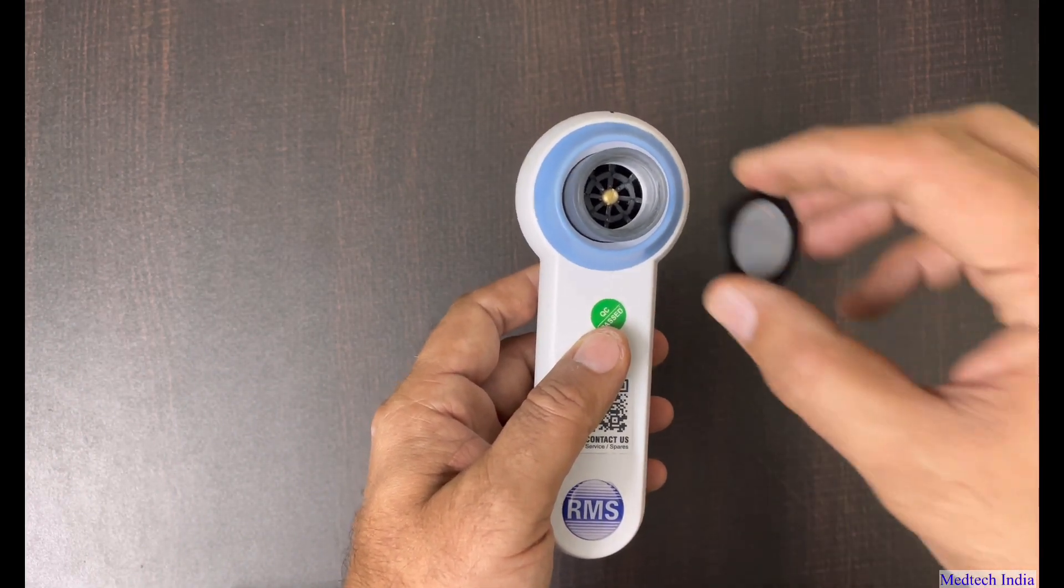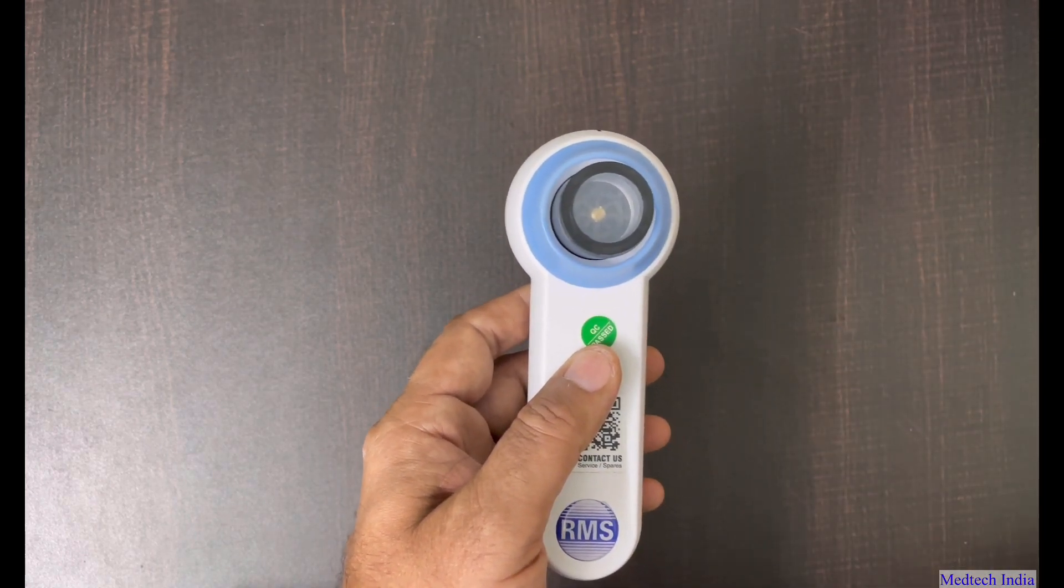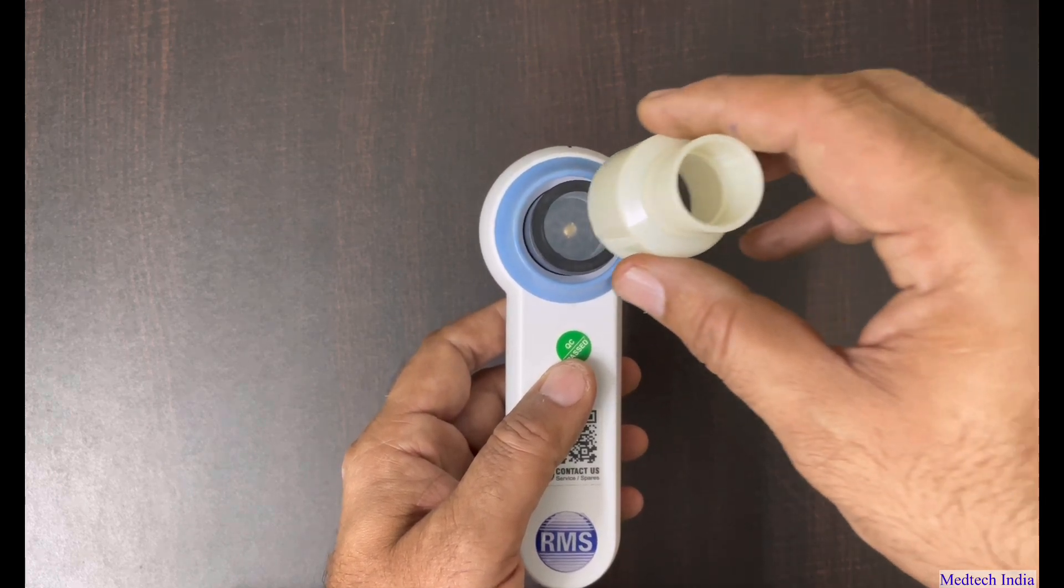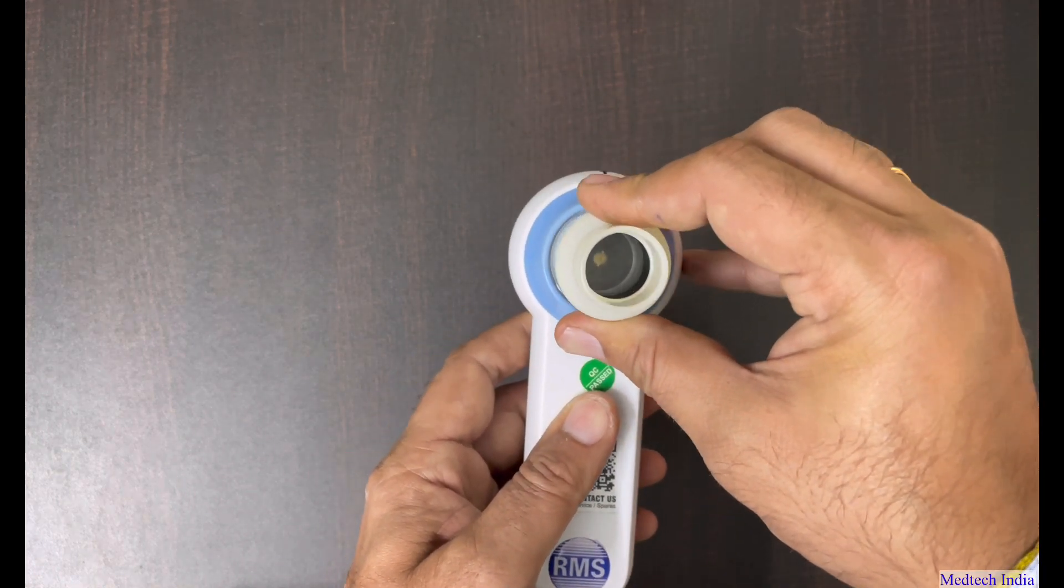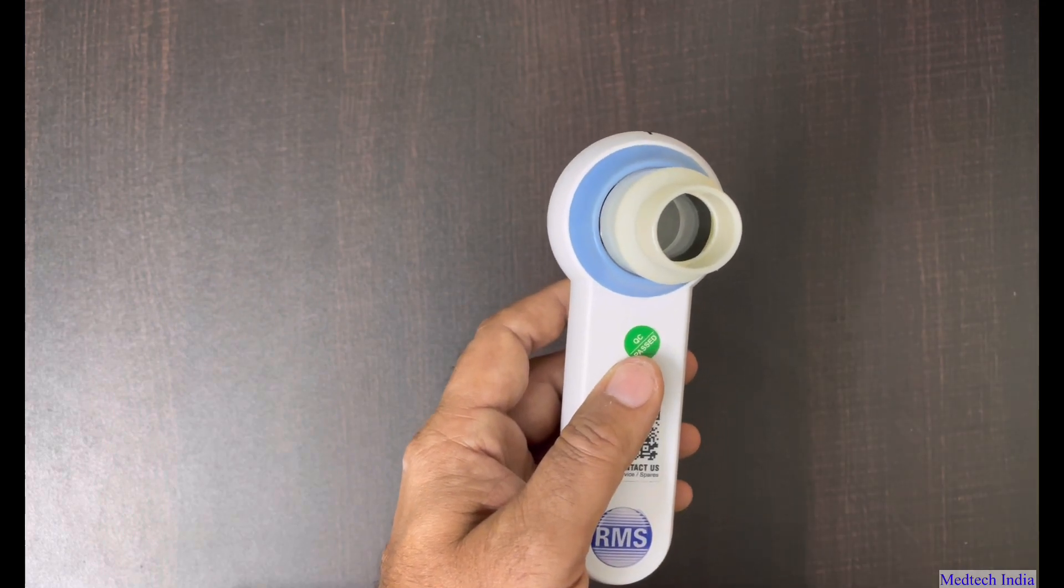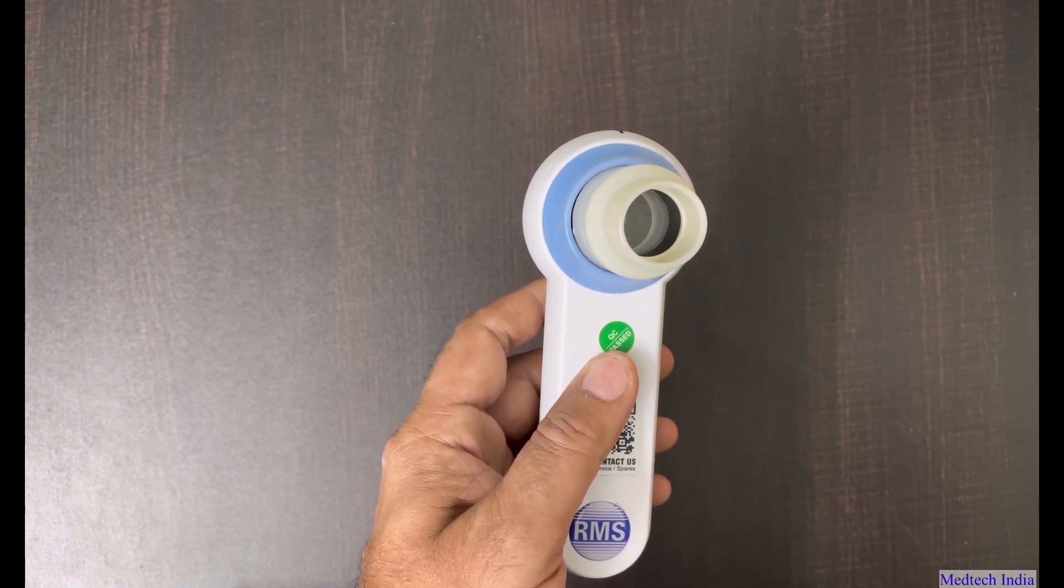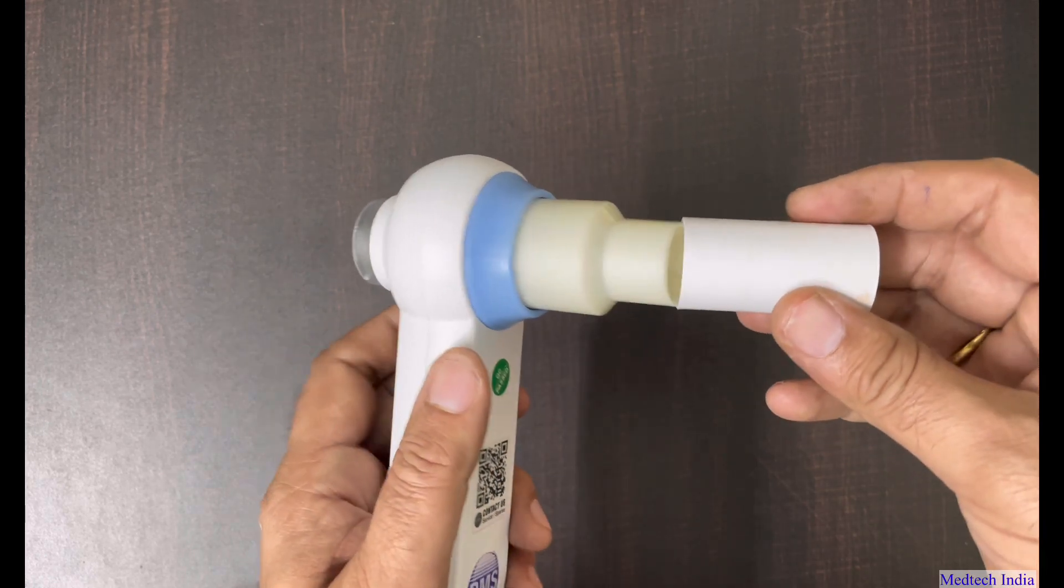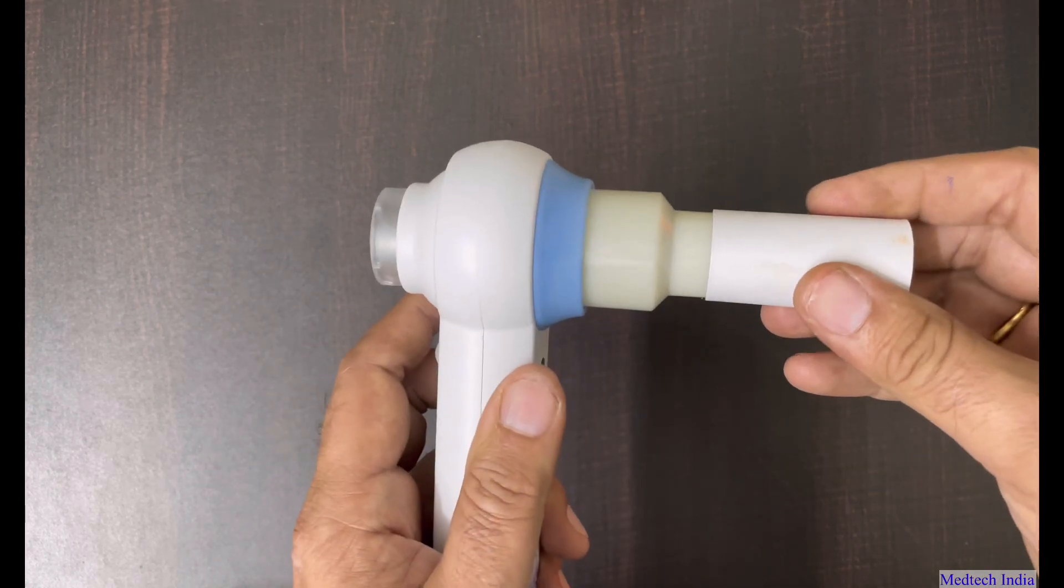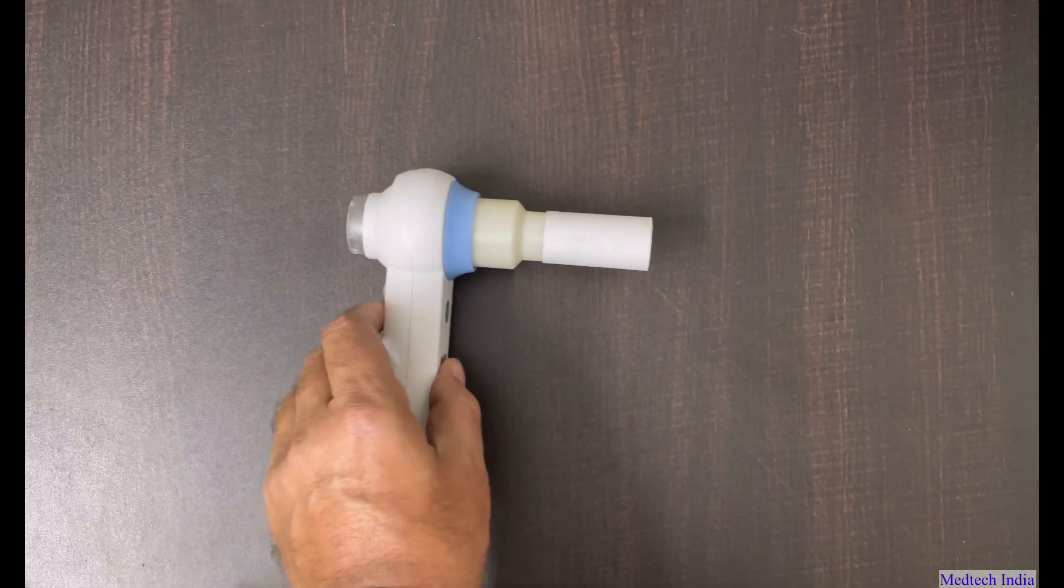Now we will keep a mesh filter on the turbine. Then we need to fix the mouthpiece holder on the turbine. So we can fix like this. Then in the last, we need to attach one disposable mouthpiece for performing the test. So from the device part, now it is ready.